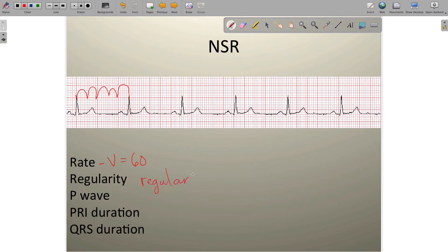The QRS complexes are absolutely regular. Now we're going to look for the presence of P waves. We find the QRS complexes and go immediately before each one, looking for an upright and rounded shape. Here there's a P wave, here there's a P wave — this thing has perfect looking P waves. They're not too tall, they're nice and rounded. There is a P wave, and there's one for every QRS complex, appearing only right before the QRS.